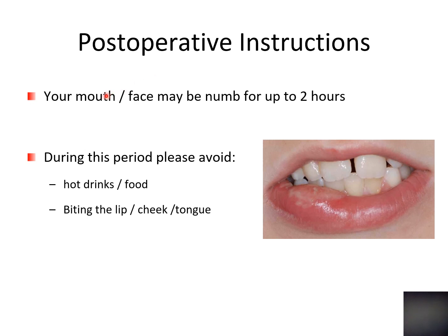And finally, you should be able to provide appropriate post-operative instructions to your patient following LA administration. These are primarily aimed at preventing soft tissue trauma. It can take anywhere between 1 to 3 hours for local anesthetics in the mouth to wear off, but on an average, 2 hours is appropriate.